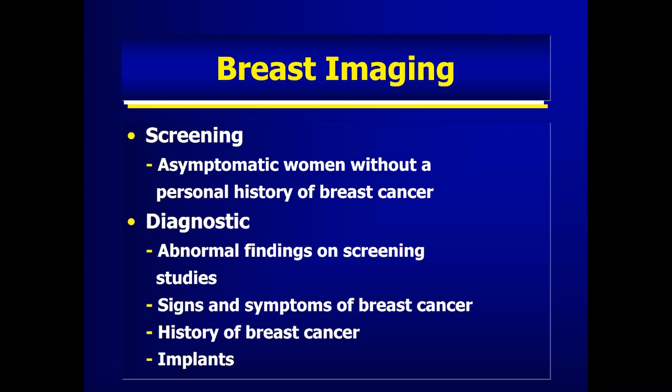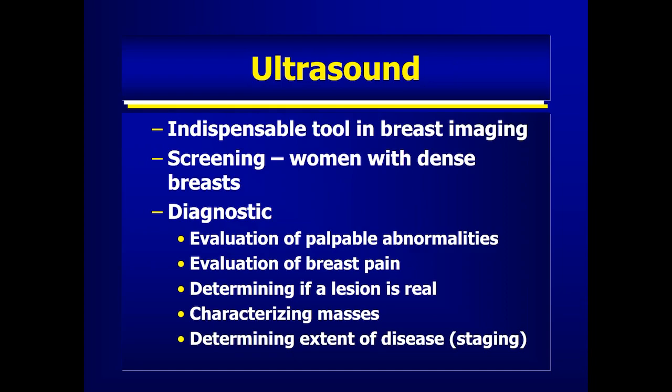The bulk of what we do in breast ultrasound is diagnostic work, where we have abnormal findings on screening mammography, or we're looking at patients who present with signs and symptoms of breast cancer, or they have a history of breast cancer and they're coming for surveillance, or sometimes when we're evaluating patients with breast implants. Ultrasound really is an indispensable tool in breast imaging.